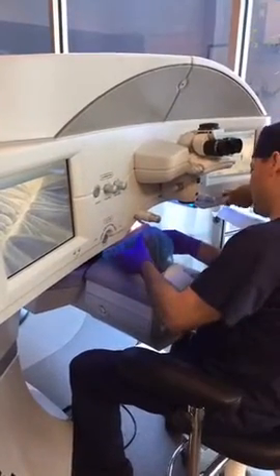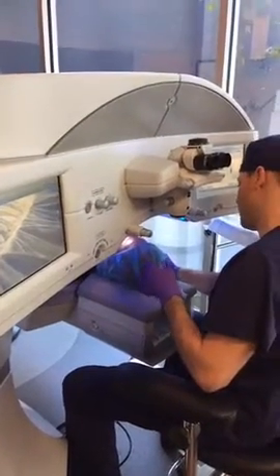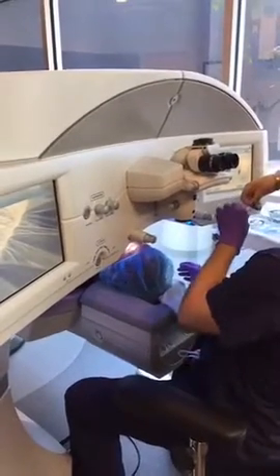Okay, so I'm going to rotate your head a little bit this way now, and then chin up slightly. Are you having any pain? No pain. My eyes watering. Eyes watering, yeah, that's fine. Mm-hmm. Absolutely.